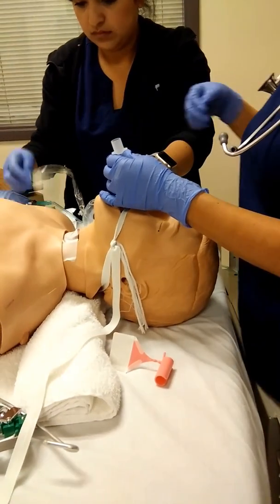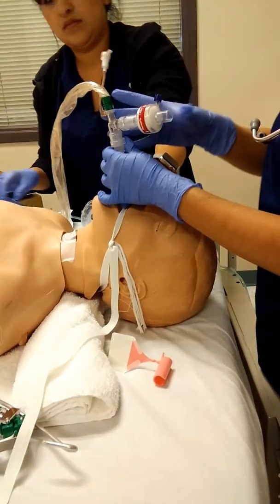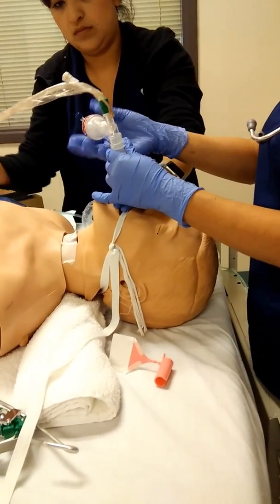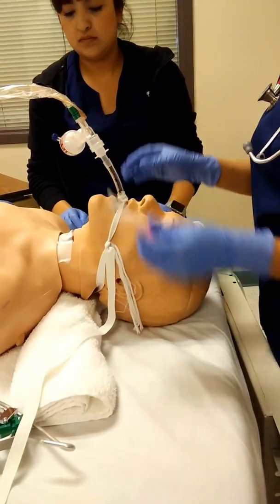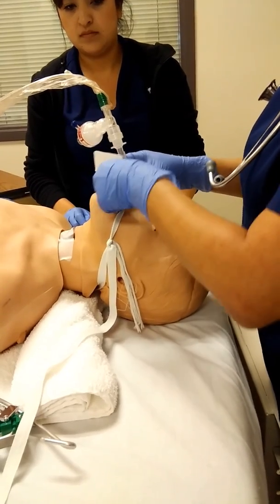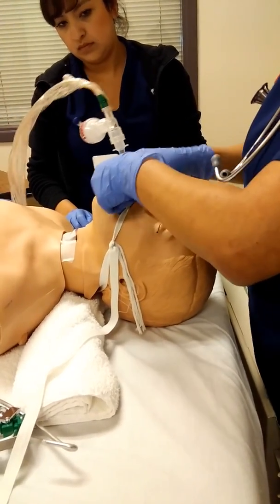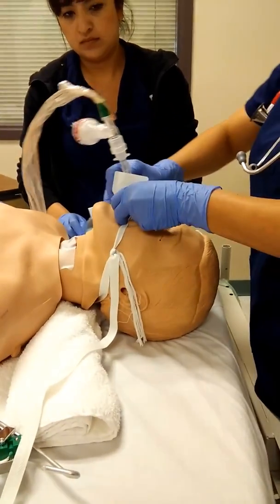So we could go ahead and place them on the ventilator, on the mechanical ventilation, and attach the HME to it. And then we could go ahead and place the bite block in there because we need this. We don't want the patient to be biting our finger off later on when they wake up.